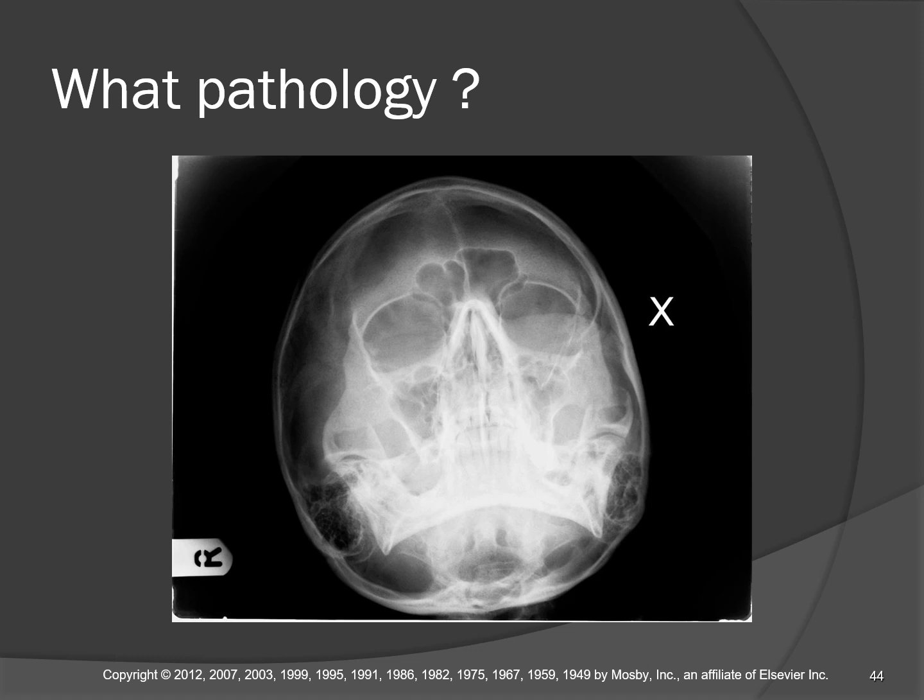And those extra lines, that's the fat pad that your eyeball rests on, dripping down into the fracture and hanging in the middle of the maxillary sinus, very much like a tear that refuses to fall. So the teardrop sign is the sign of an orbital blowout fracture. You need a modified Waters projection, which is what this is, in order to effectively diagnose orbital blowout fracture. I will cover this again in the skull unit. Have no fear. It's actually a facial bones projection.